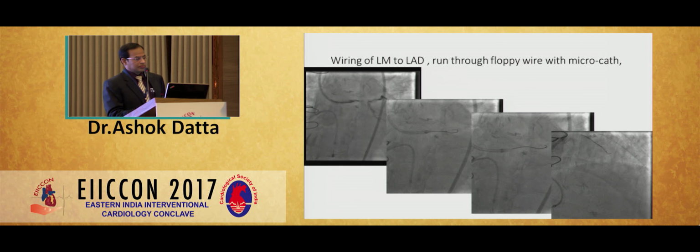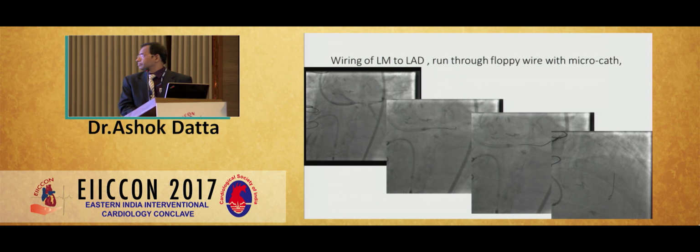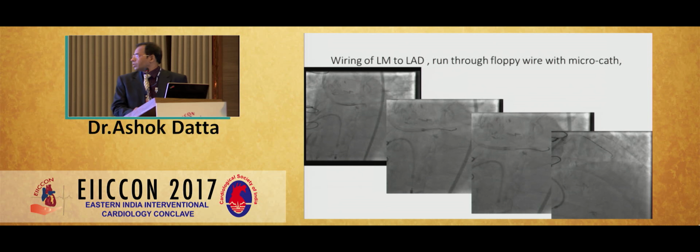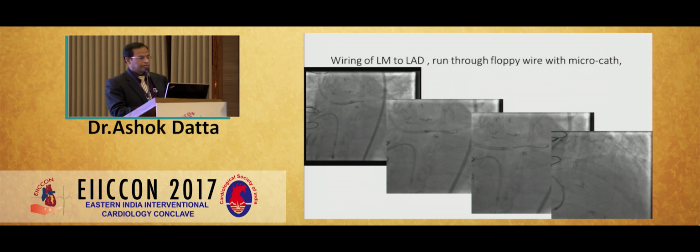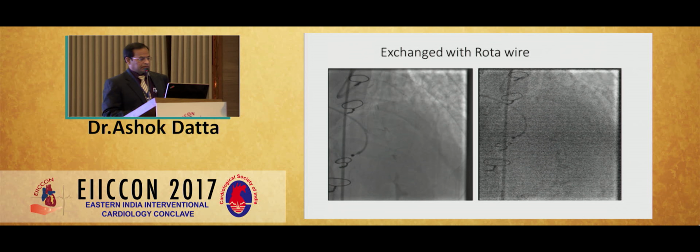Now, wiring of the left main to LAD was done with a floppy wire with the help of a microcatheter, Fine Cross. That was challenging, but anyhow that was successfully done. There's a lot of calcium in the left main as well as the proximal LAD, so we planned for rotablation, exchanging with the RotaWire.